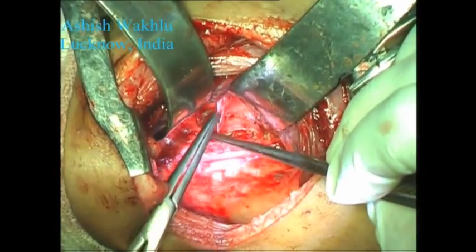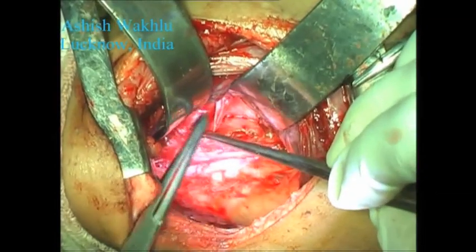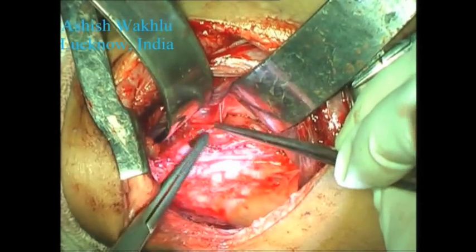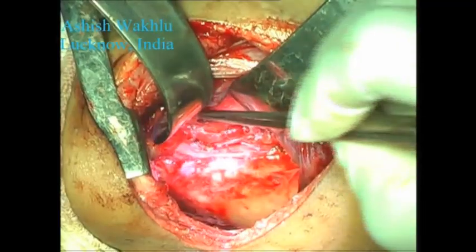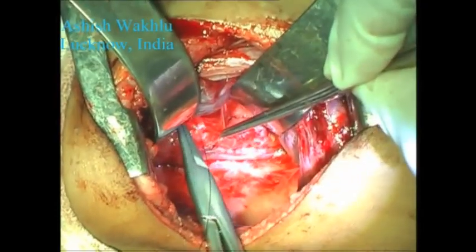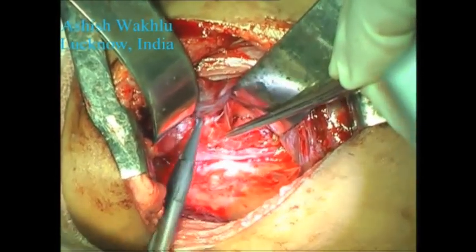The tissue at the tip of the stump of the right main bronchus is held in the thumb forceps, and we will now apply a couple of stay sutures to secure the stump, open it, and then anastomose it to the bronchial bifurcation.